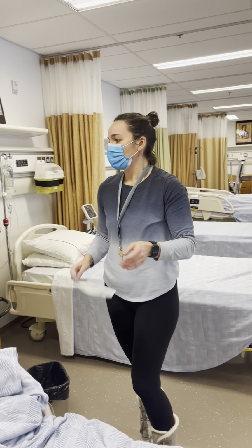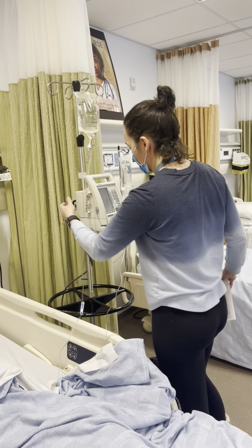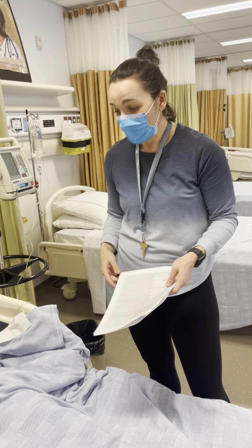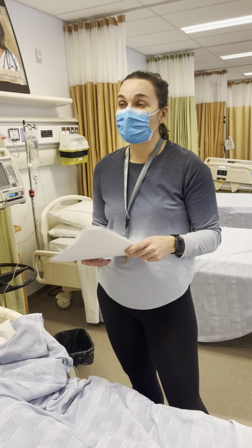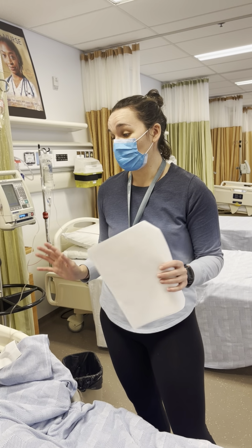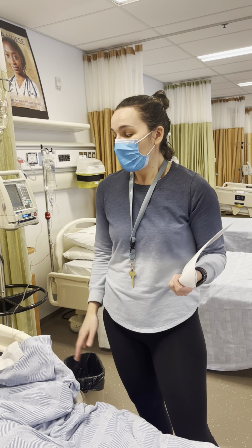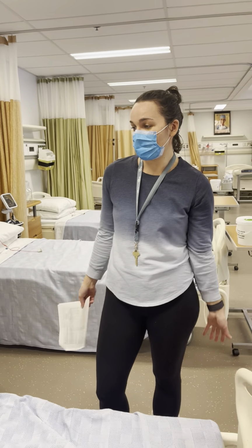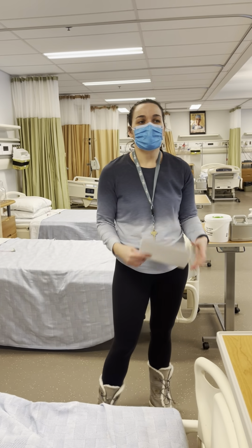Now we can lock our pump and we will do our final safety check. Explain to him again if he's feeling any signs of hypoglycemia or any changes in his state to be sure to ring the call bell. Tell him we'll be back in an hour. We'll put our bed down, do our last safety check, and then we'll go document.